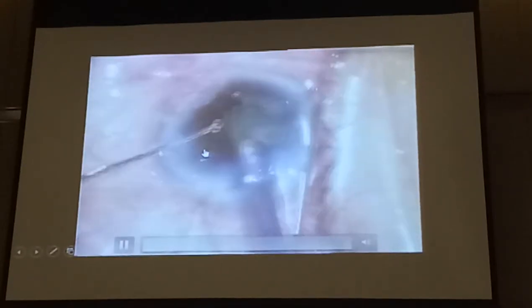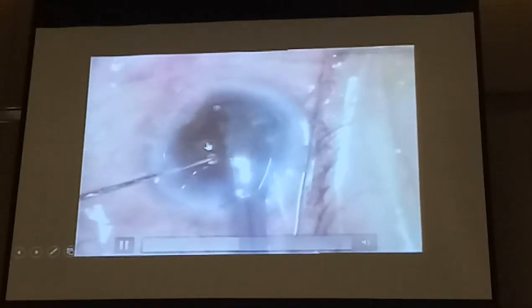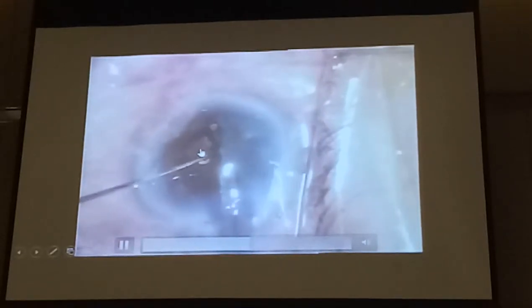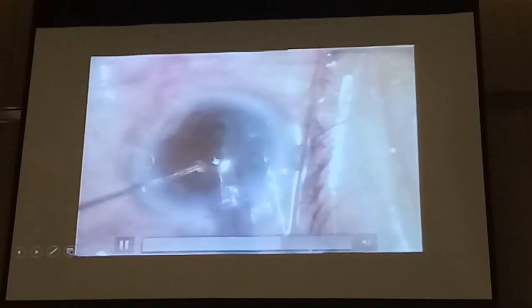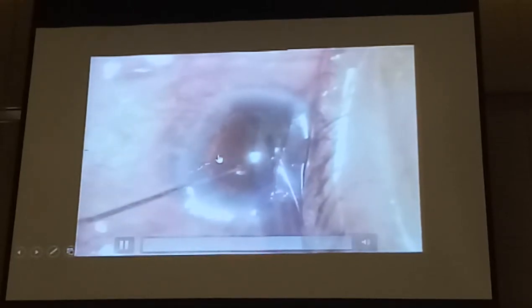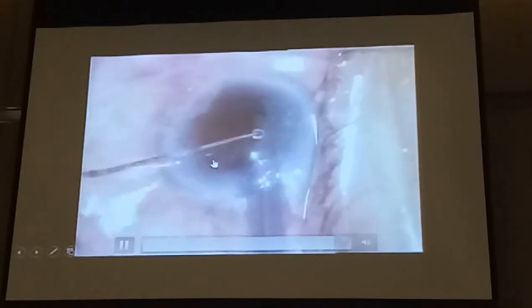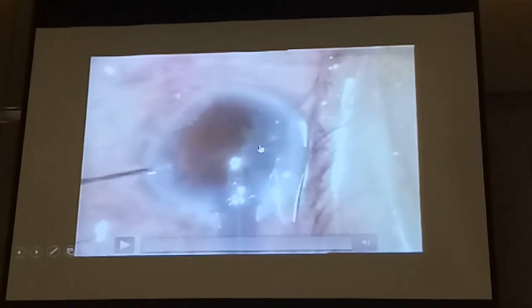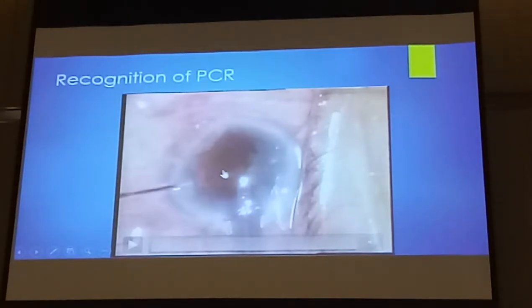Watch here — these fragments are floating. Look at this fragment — it's floating. It's not normal. And that's when the vitreous got caught. The surgeon continues. If you continue further, it will drop. Actually, this fragment started to drop. You saw the sudden movement within that fragment — it was when the vitreous got caught by the probe.